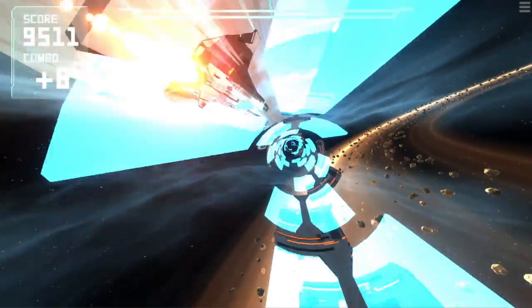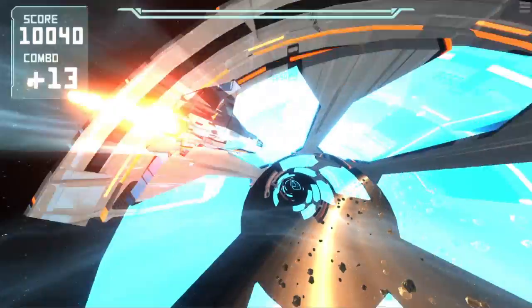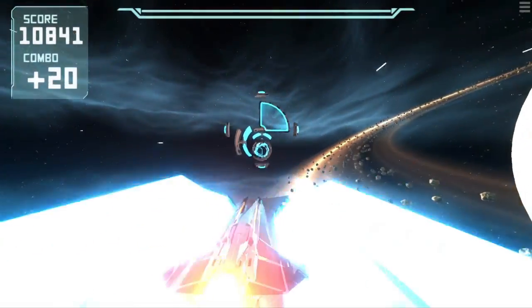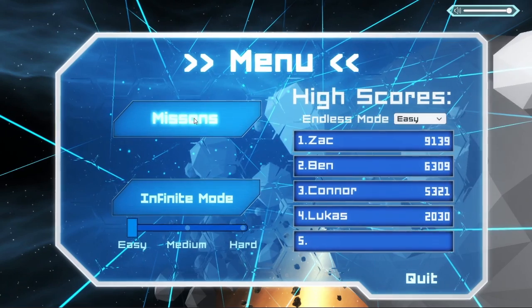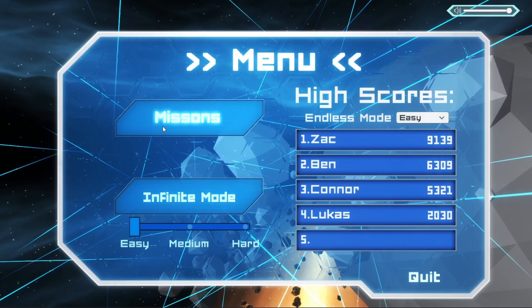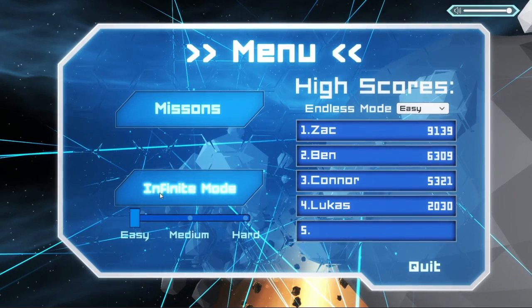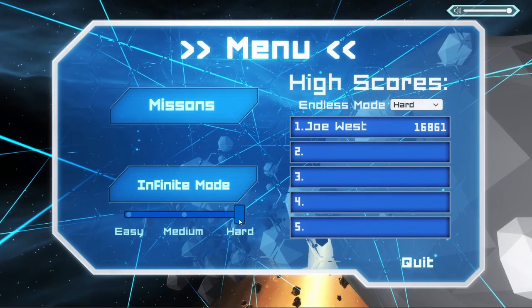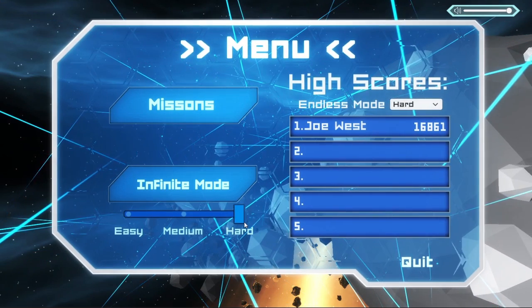First, let's take a look at Neozen. In this game, the player must use their balance to steer a spaceship, hitting speed boosts and flying through rings to maximize speed and points. There are 2 modes. Missions put the player on pre-designed tracks, which you can customize for specific patients. Infinite mode generates a new track every time, increasing the difficulty until the player runs out of fuel.